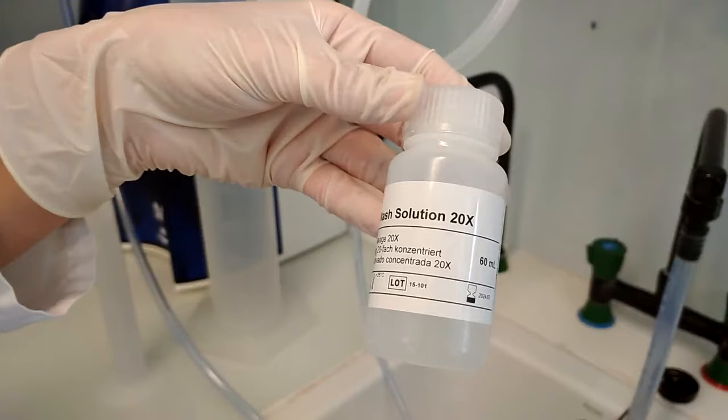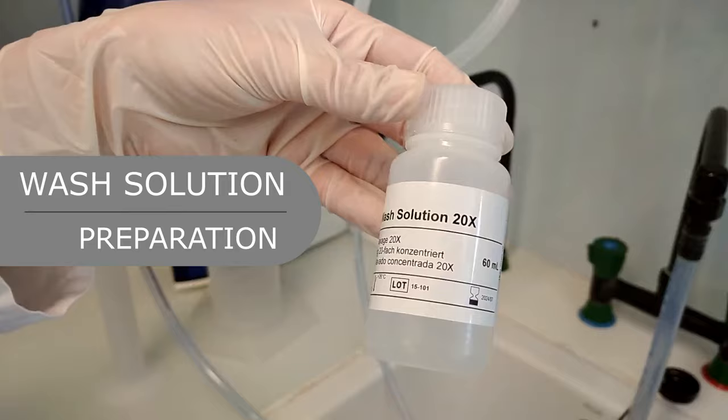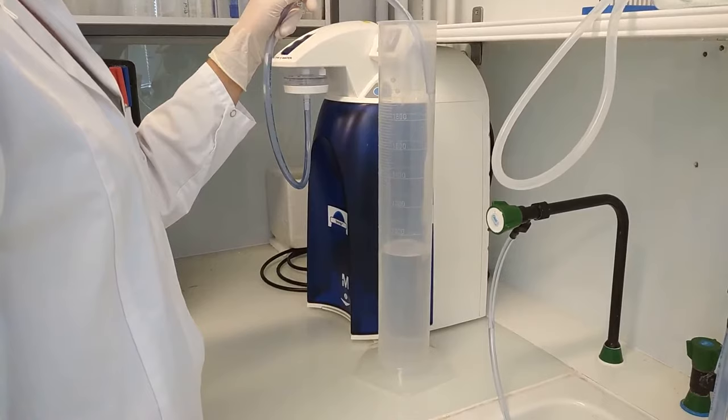Wash solution preparation: Mix thoroughly to ensure that the wash concentrate is completely solubilized. Prepare the wash solution by diluting the wash concentrate 1 to 20 in distilled or deionized water.